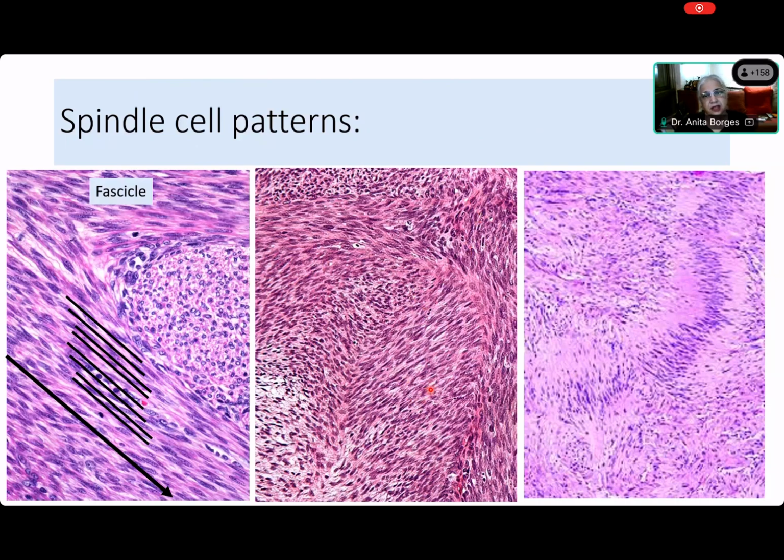Use the thickest, any color that you want, but use the thickest, the little dots at the bottom. Press on the thickest dot, and show me where you can see the herringbone. You're right, it is herringbone. Oh, it's going. That is not a herringbone. No, here, that's not the herringbone. So let us see where the herringbone is.